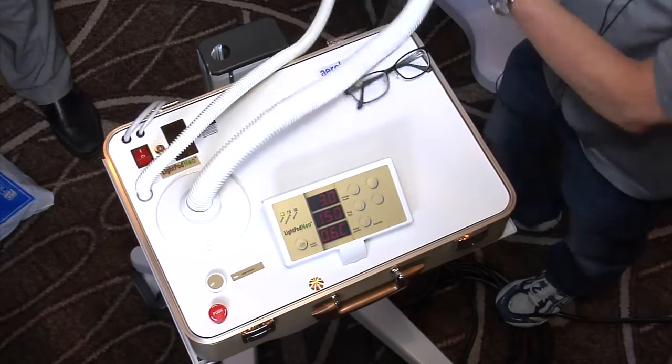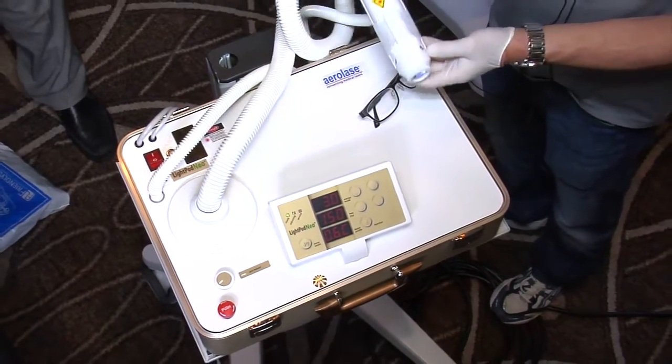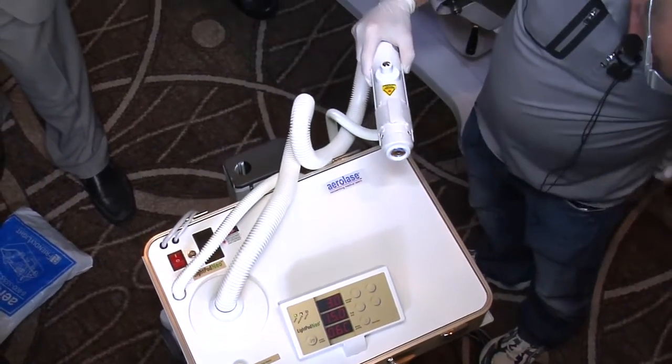So it's really, really small. This is the firing piece of it. There are no consumables for this device.